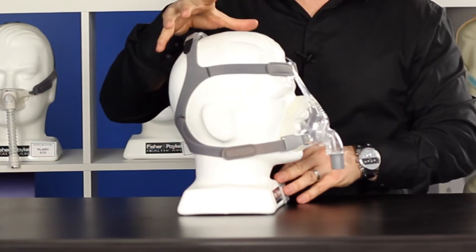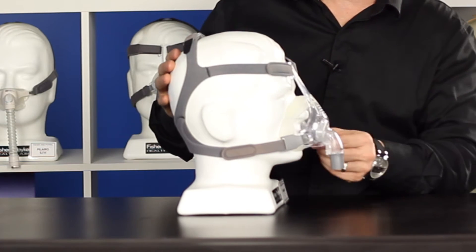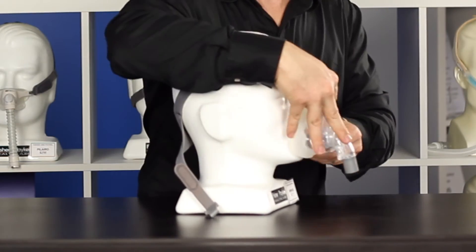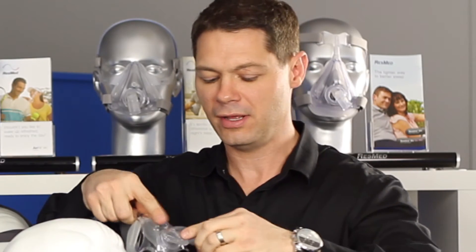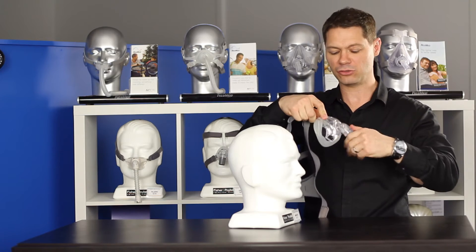The headgear is adjustable in many different areas — on the top of the head, on the forehead, and also around the sides. It has very easy to take off clips. That little connector stays in your long tube for bathroom breaks as well — you can just pull down on the tube to disconnect it. The elbow moves all the way around, so that's quite flexible.